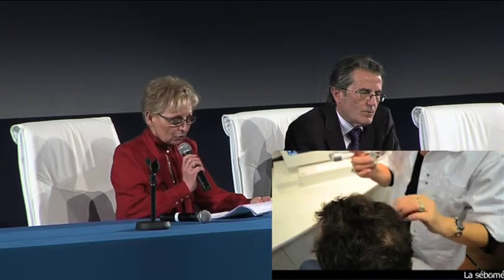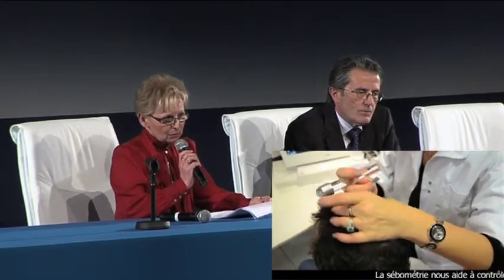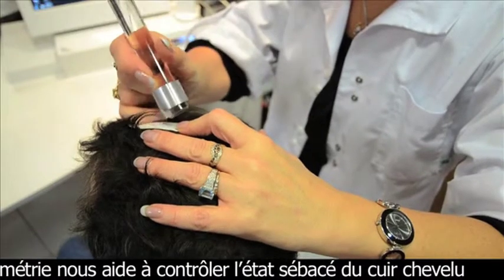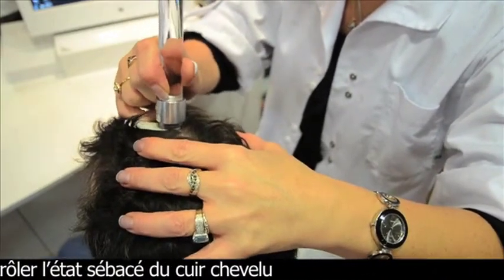Capilloscopy will show us with very detailed enlargements the state of the scalp so that we can treat aggravating factors if there are any. Then we can monitor it. Sebometry, as its name indicates, will allow us to measure the amount of sebum fabricated that day, and this is once again monitored later on in the procedure.